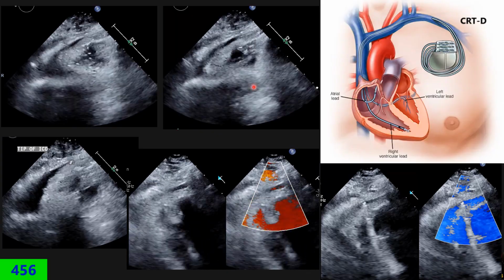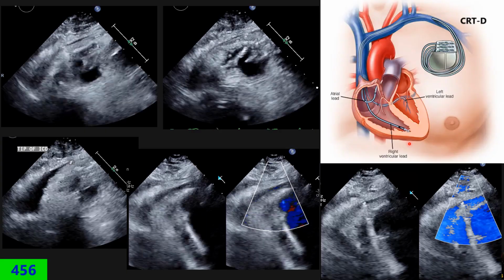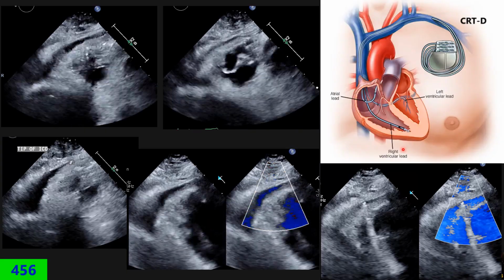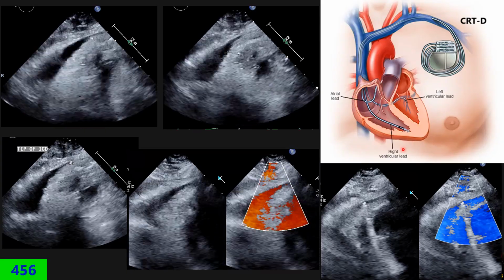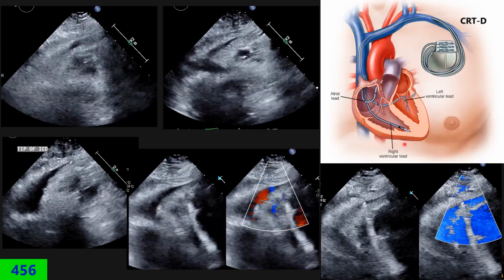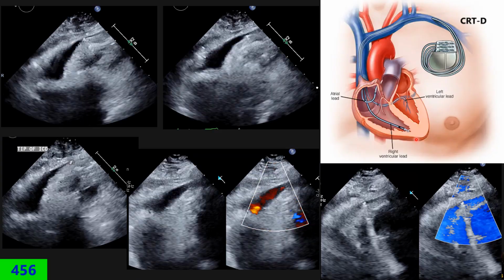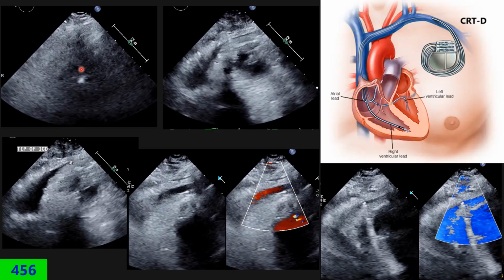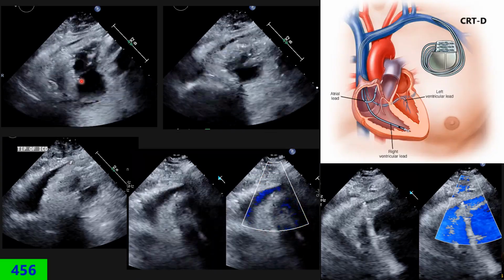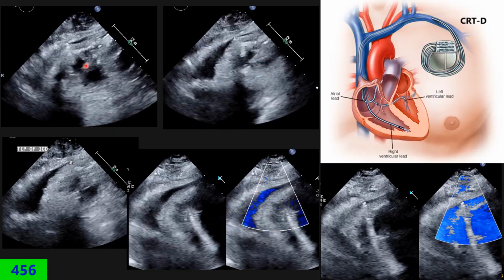If we cannot see the tip of the lead, we can move the medial view a little higher or lower, following the wire and twisting clockwise or counterclockwise, and meanwhile fan up or down slowly, chasing the wire until we can see the tip of the electrode.